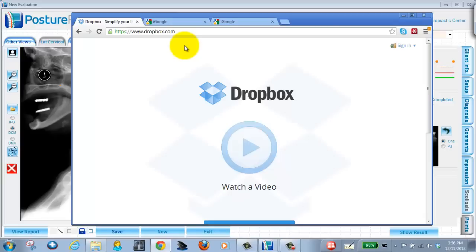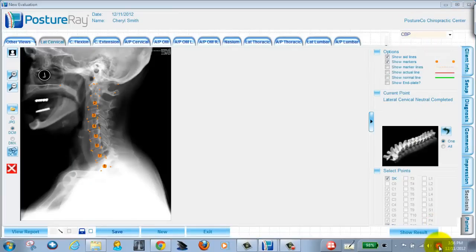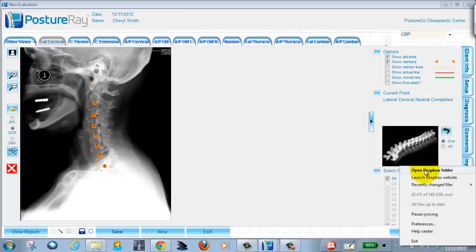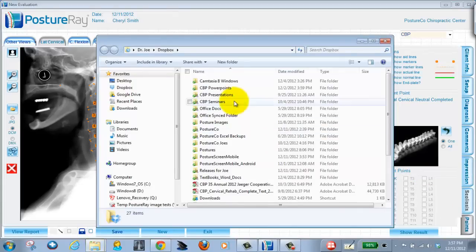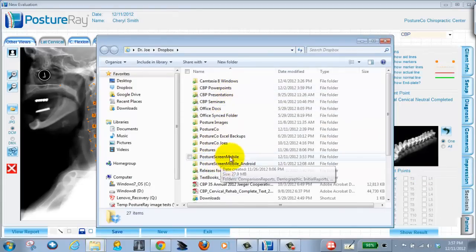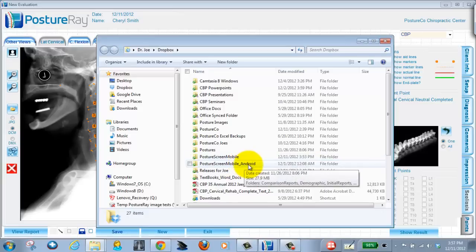So that is installed on my system and if you look right here you can see this little icon down here it says Dropbox. If I go ahead and open this up and I can click open Dropbox folder, you're going to see all my files and there's two files right here. One is Posture Screen Mobile, which is the Apple version. One is Posture Screen Mobile Android.